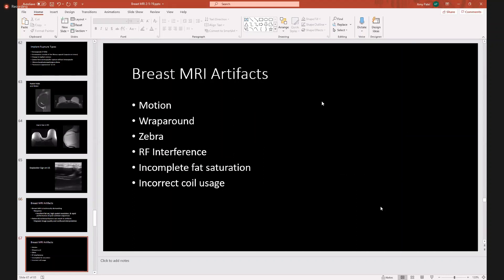The most common breast MRI artifacts are motion, wraparound, zebra, RF interference, incomplete fat saturation, and incorrect coil usage.